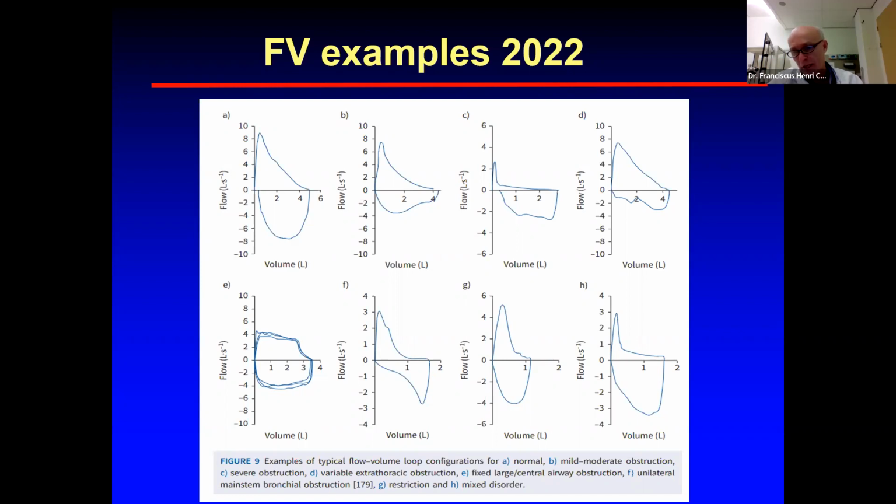You can see, okay, this patient perhaps could have blown out further. Yes, the shape of the flow volume curve is very informative. Although these decision trees are also based for people who don't have the nice graphs with handheld spirometers, I always will look at the graph as well. Yeah, I'm a big fan of the flow volume loop as well.